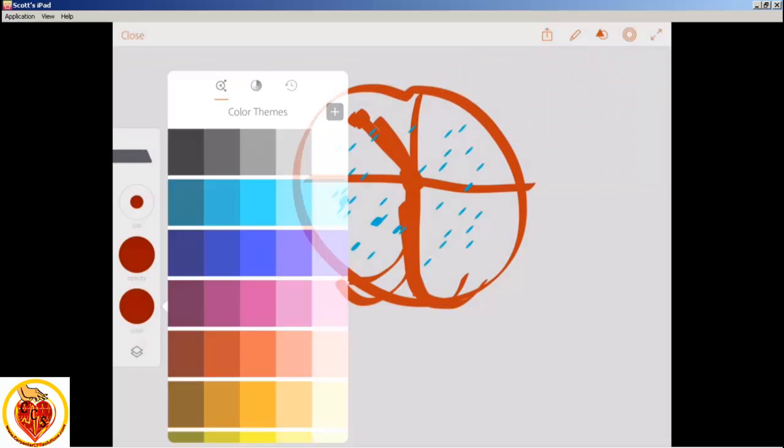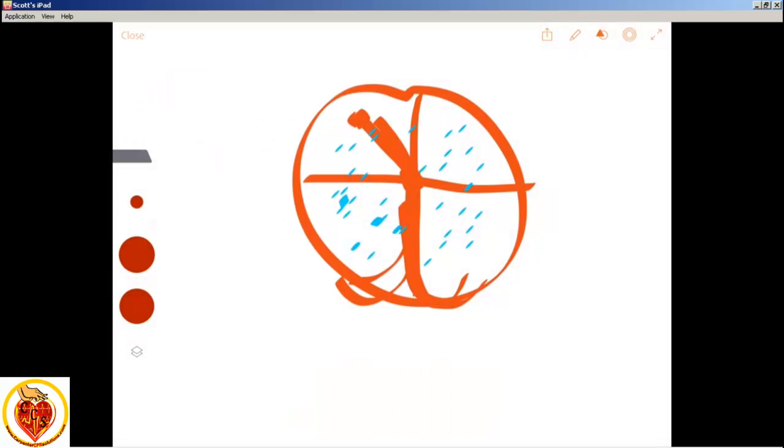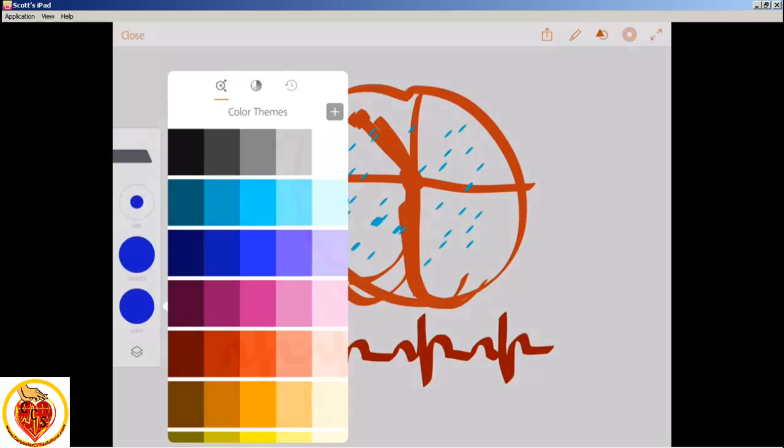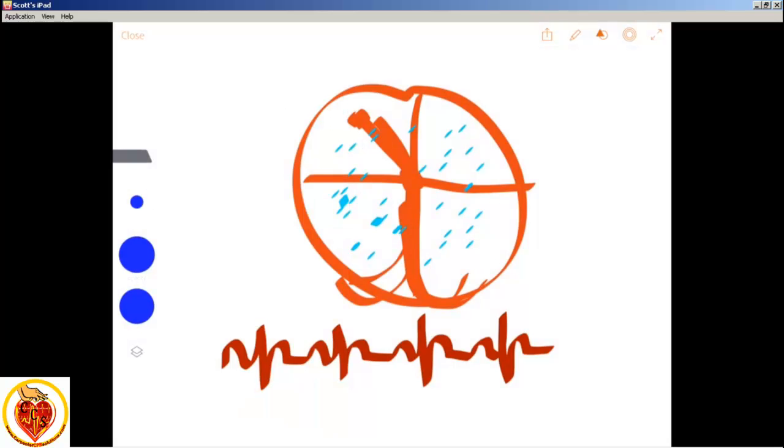So our initial rhythm, when we first took a look at this, top to the bottom, if you were going to graph it, would look like this. And you don't need to know what this means. What I want you to recognize is that it's coordinated, it's repetitive, it makes sense. There's a picture there. And if you have a heart that is in ventricular fibrillation, you end up with just this chaotic looking thing that is just quivering all over the place.